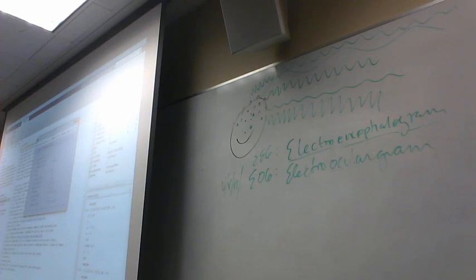We also have a different type. Now, most of brain activity is going to happen under, let's say, at least in the ERP, about 30 hertz. That's a lot of what we're going to be interested in. And so we don't really need a lot of this stuff north of here. We're going to focus on most of this stuff south of here. In particular, a lot of the brainwave frequencies that a lot of people look at, you can further divide them into different segments, and we give different names to them. So let's say 4 hertz down to 0, we call that delta.